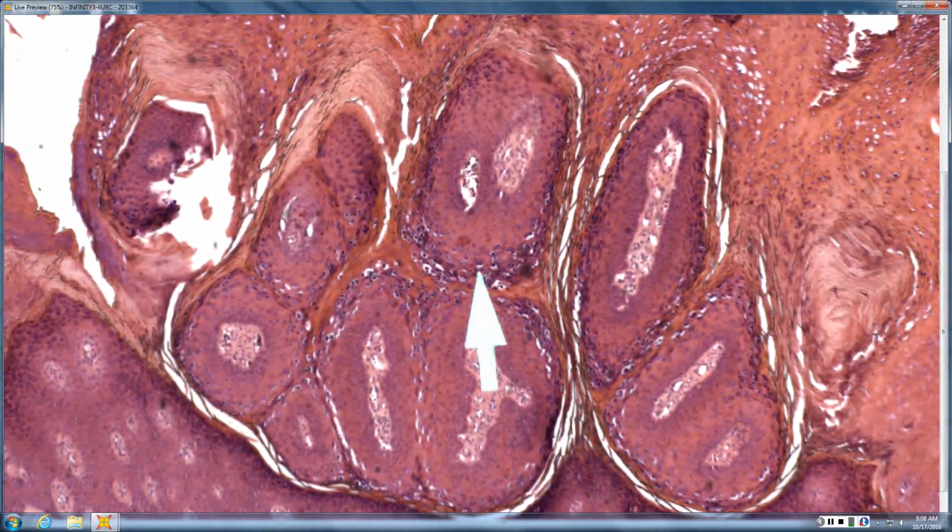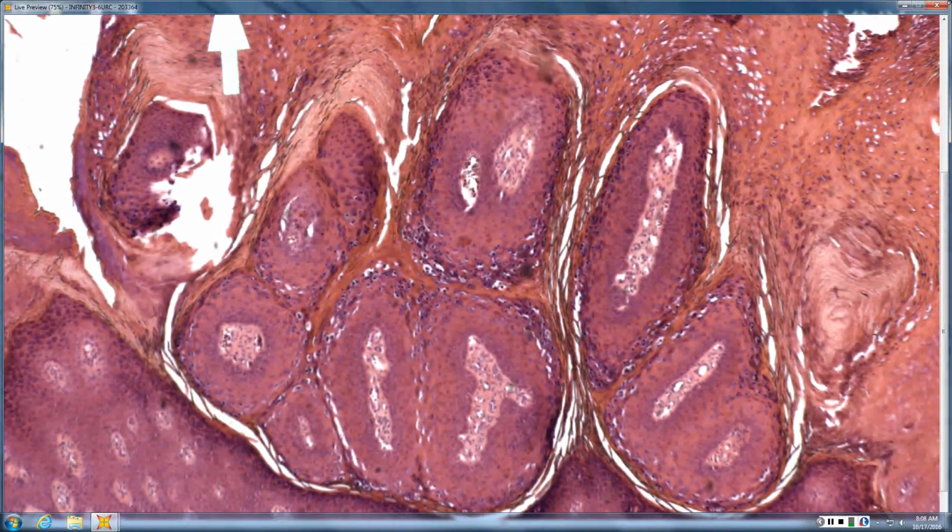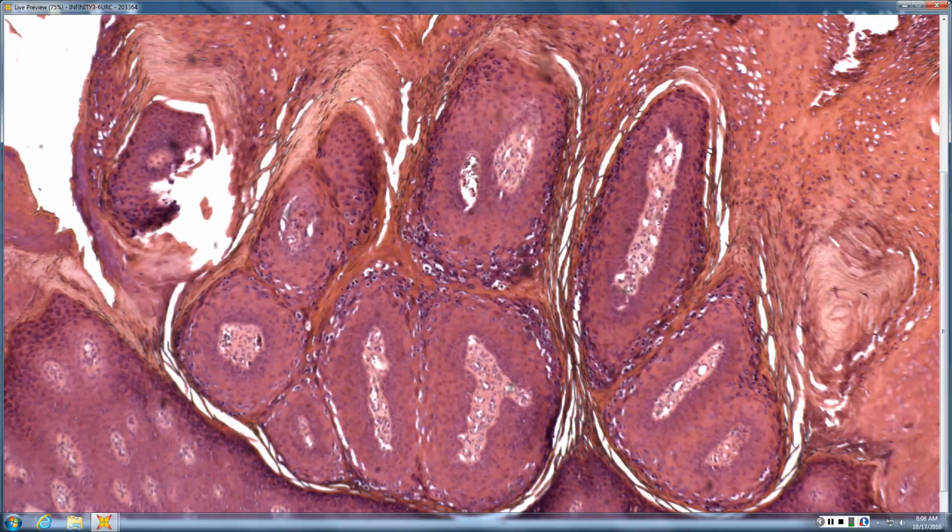Yeah, I thought this was maybe a wart, condyloma. Lots of little EDV changes, those bluish ones, but I'd say definitely wart. When you have a compact corneum and it looks like you've taken a little cookie cutter and cut round to oval holes in your corneum, like up in this area, that is typical for a wart.